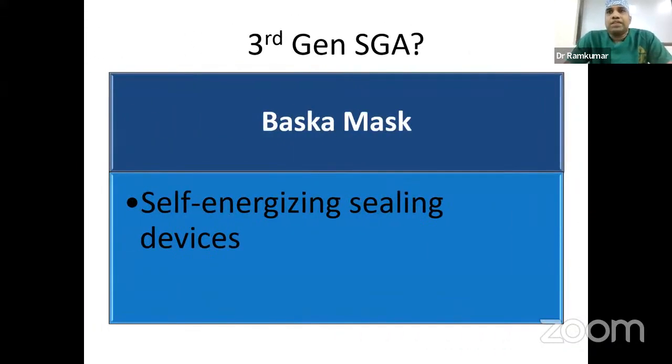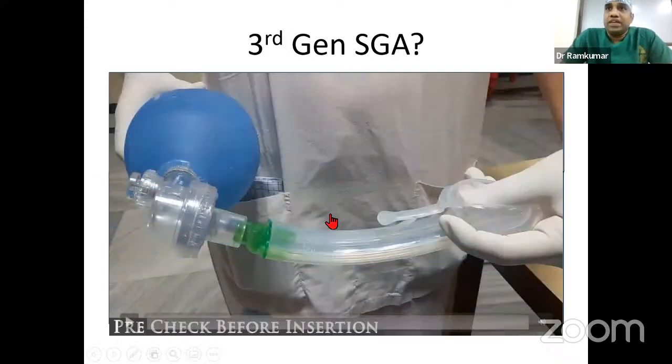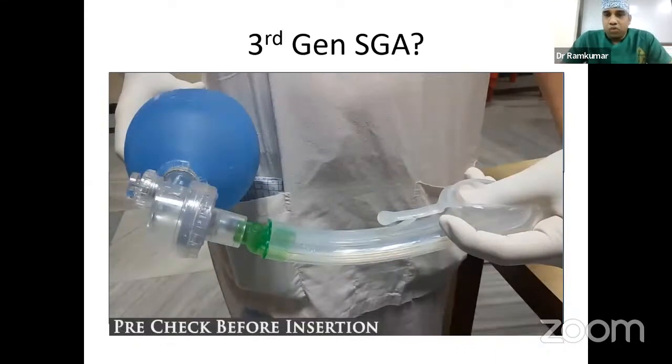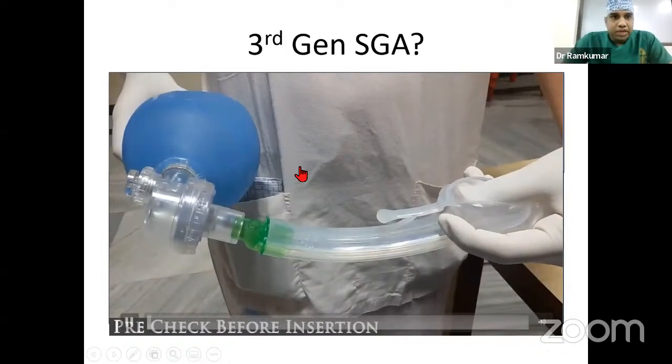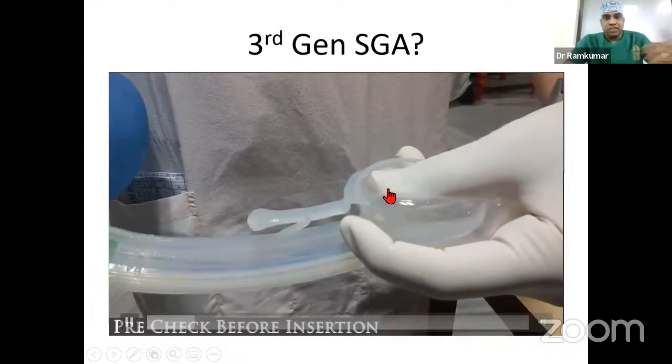But in recent times, there are articles saying that the Baska mask is a third generation device. Why is it placed as a third generation device? Because of the self-energizing sealing mechanism. This has a silicone semi-membranous cuff, which is an open cuff, which tends to get a seal with a higher oropharyngeal leak pressure or higher airway pressure. I'll just demonstrate how this cuff works. See, when you ventilate, you can observe here that the cuff tends to move anteriorly, that is, upwards.